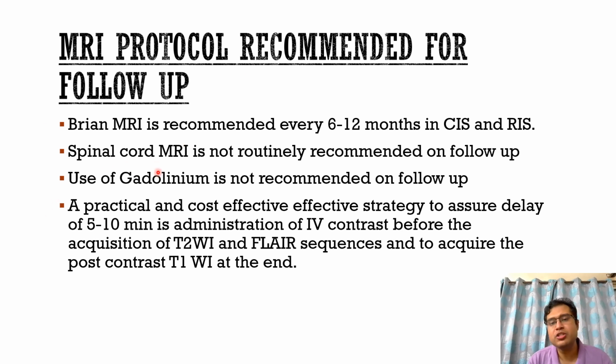The use of gadolinium is not very commonly recommended on follow-up until required. A practical and cost-effective strategy is to give IV contrast and assure a delay of 5 to 10 minutes before acquisition of T2 and FLAIR sequences, which are not affected by IV contrast, and then acquire the post-contrast T1 at the end. That saves time.